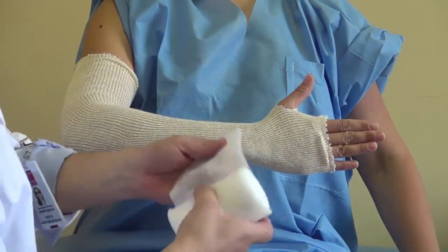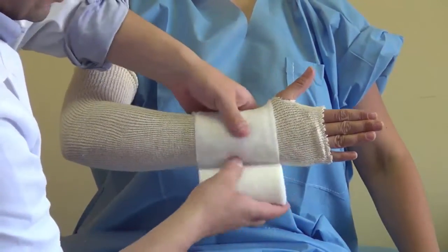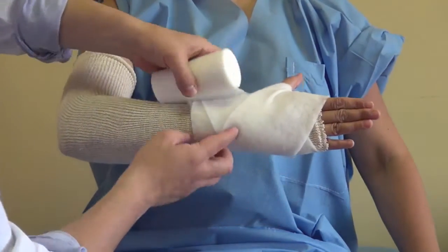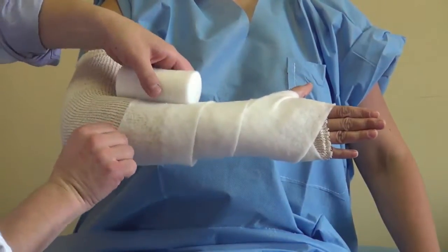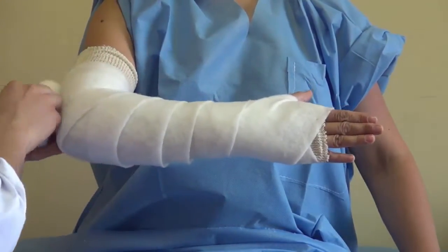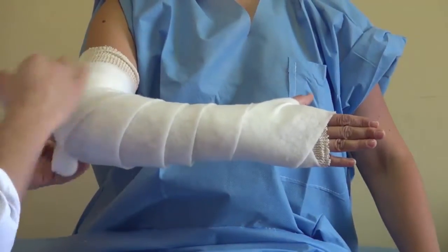Then we use some padding, going around the wrist to protect it, then around the hand. We use just one small wrap around, going to the elbow. At the borders, we use a little more padding for protection around the cast.